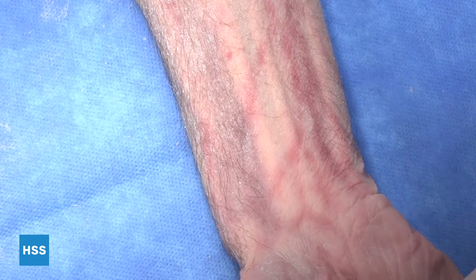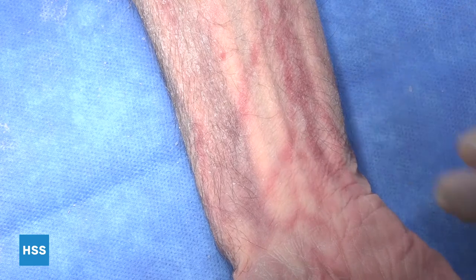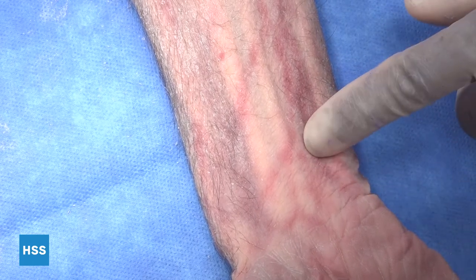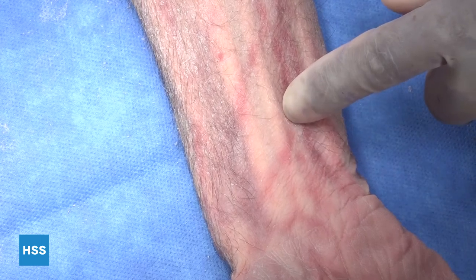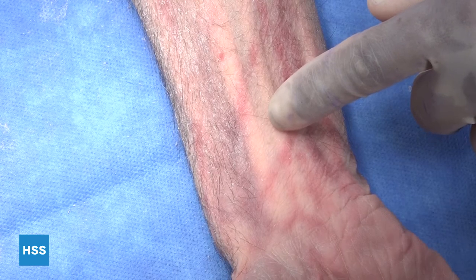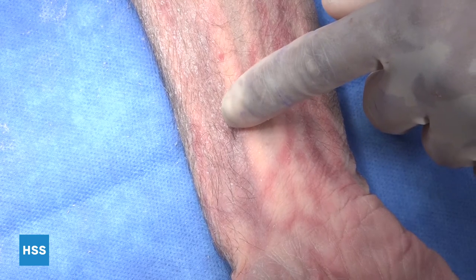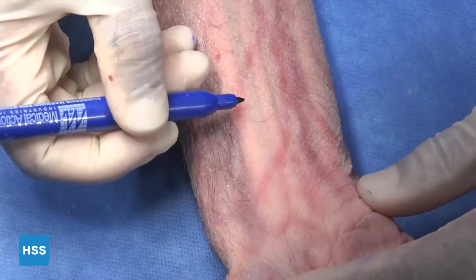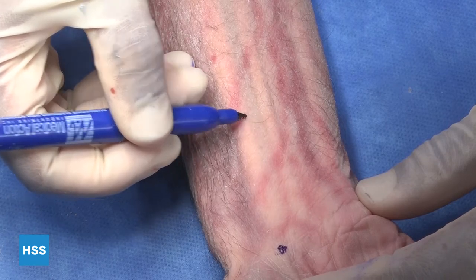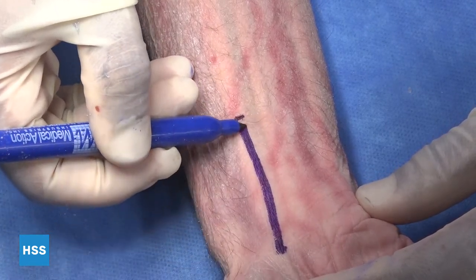The distal aspect of our incision will be the wrist crease, and the actual incision will overlie the flexor carpi radialis tendon. You'll see two tendons right here that are clearly visible. The more medial or ulnar one is the palmaris longus tendon, and the more radial one is the flexor carpi radialis, or FCR tendon. Our incision is going to start right here at the wrist crease, and go about four to five centimeters approximately directly over the FCR tendon sheath.